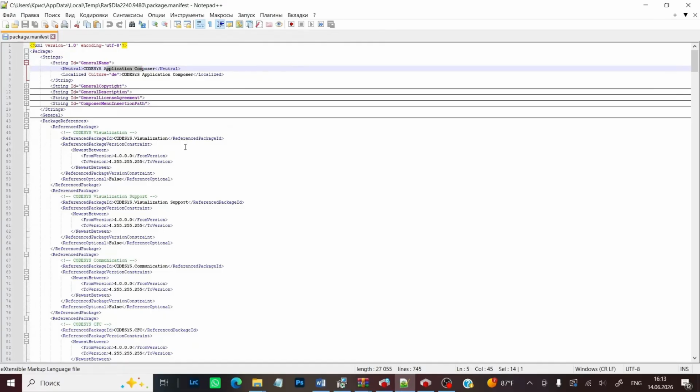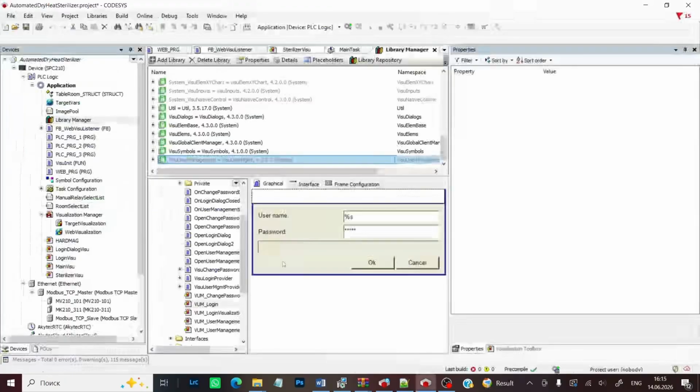So go ahead and remove it, then update the visualization package to version 4.3. If you need the composer, just reinstall it, since we can see that it will work with visualization version 4.0 and above. I've already updated this package version, and now all the built-in authorization and user management dialog windows will work. But I'll also show you how to create your own custom user authorization dialog window.